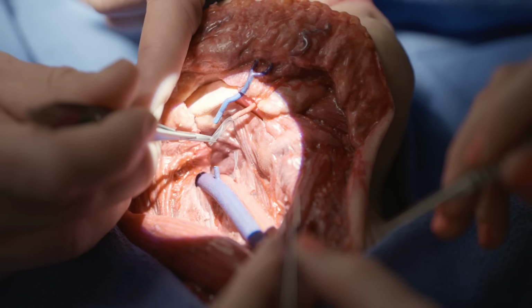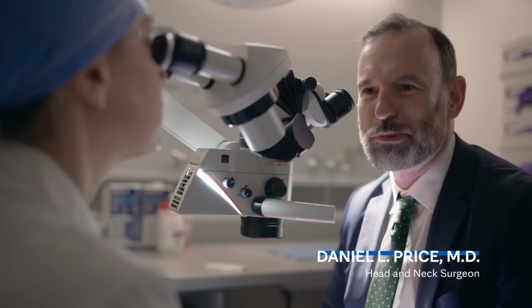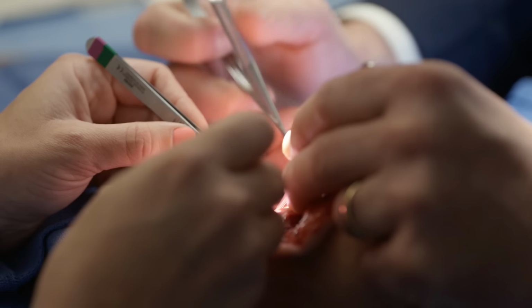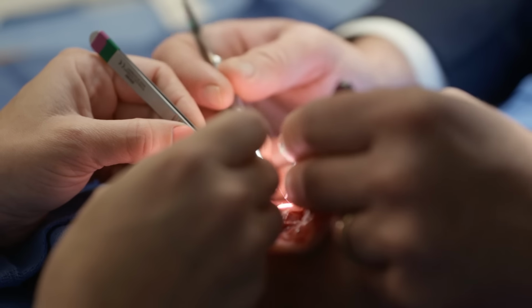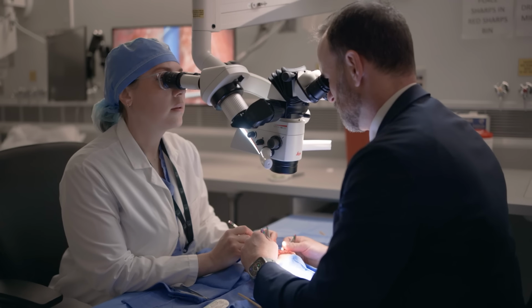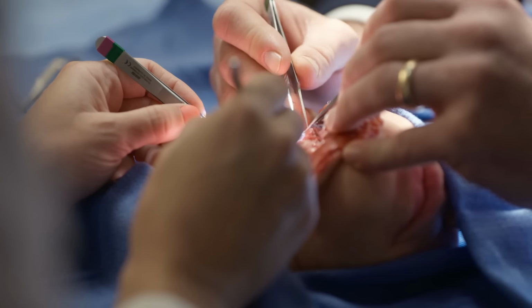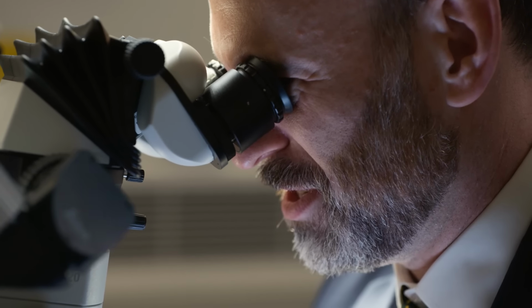We've got a task trainer here for sewing two blood vessels together. So we have to make sure that we do this perfectly when we do it in the operating room. And the best way to do that is to have lots of experience, and we can get a ton of experience without any risk practicing these procedures. We run a simulation program every year with our incoming residents. A surgeon will practice and perfect surgeries maybe 100 times before they actually ever perform that surgery on a human body. I'd give myself a C+ because we got that little kink over here. I'd give you an A+ for each of these being pretty equal length sutures.